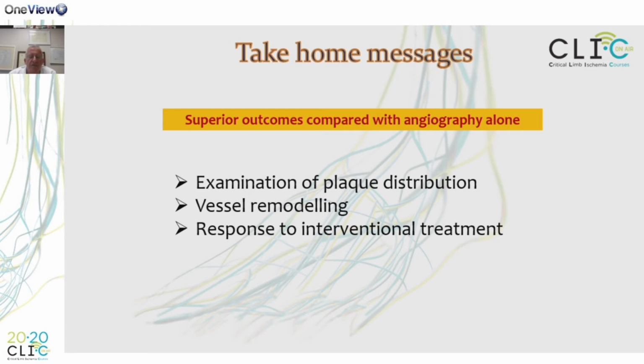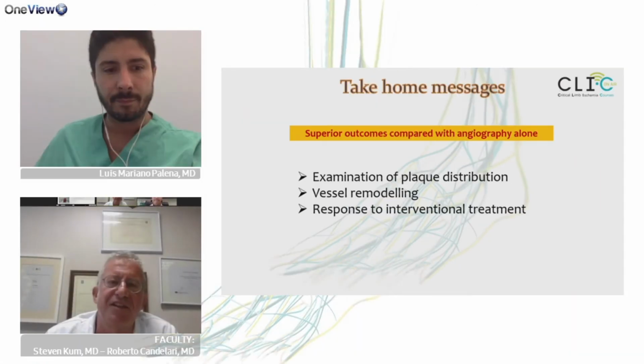The technology has provided an examination of the plaque distribution, vessel remodeling, and the response to the interventional treatment. In addition, IVUS serves as a technical adjunct for endovascular procedures that has demonstrated superior outcome compared to angiography alone. Okay, it's the end. Thank you.